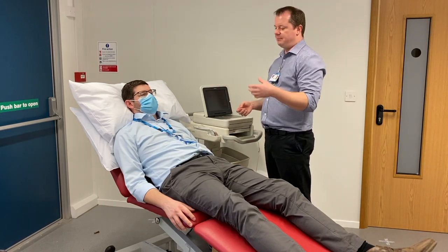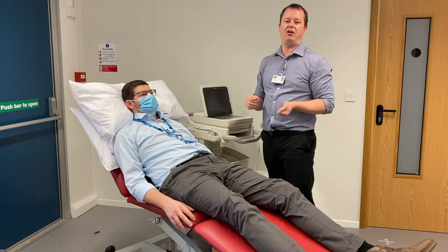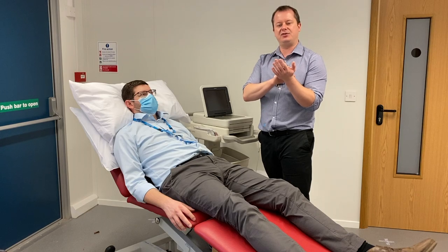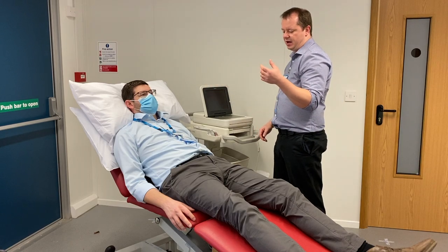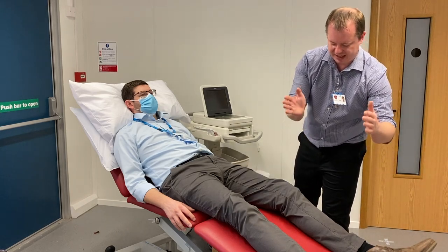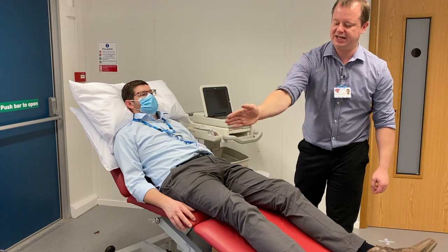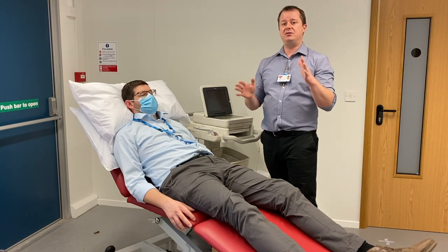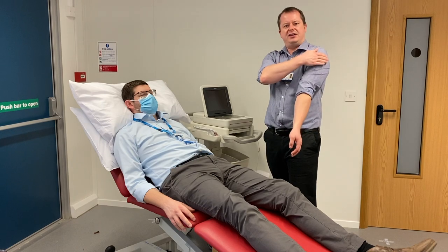Other things that get in the way include sweat, blood, or any kind of fluids — we need to make sure the skin is clean, using an alcohol wipe or soap and water, then dry it off. Drying with paper towels also makes the skin a little bit bumpy, which makes stickers easier to apply. Wounds are also a problem — we can't stick a sticker onto a wound. We don't stick stickers over jewellery either. For amputees, place the sticker just above where the amputation is, and put the opposite sticker in the same position. Patient movement is also a problem — some patients have tremors, so we might move the limb electrode position from the end of the limb closer to the body, where there's less movement.